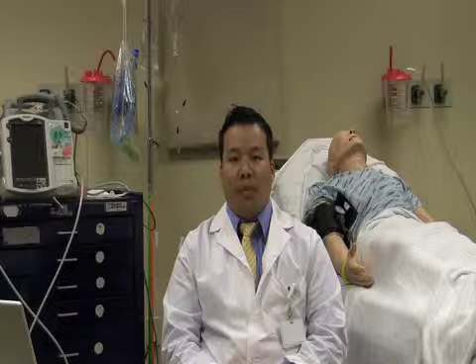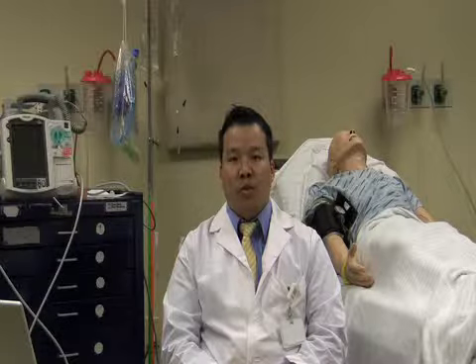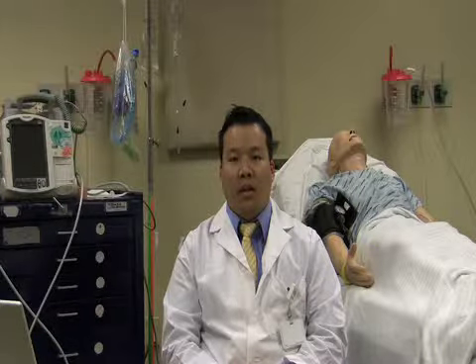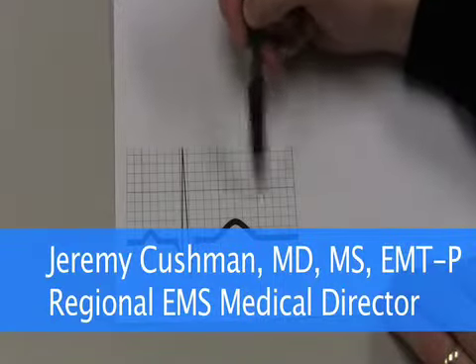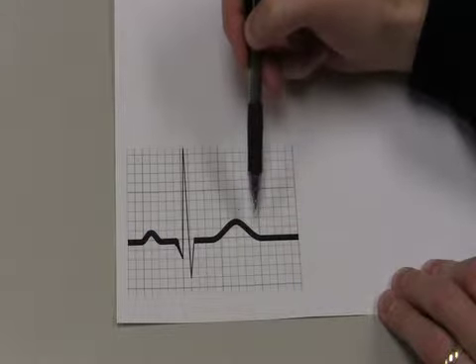If there is a dual chamber pacemaker, leads will be present in both the atrium and the ventricle. There should be 2 spikes noted, one before atrial contraction and one before contraction and depolarization of the ventricle, which is represented by the QRS complex. As you can see, this is a normal EKG with a normal P, QRS, and T-wave complex.